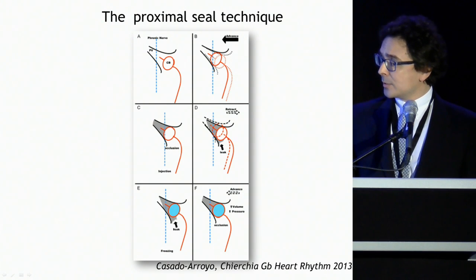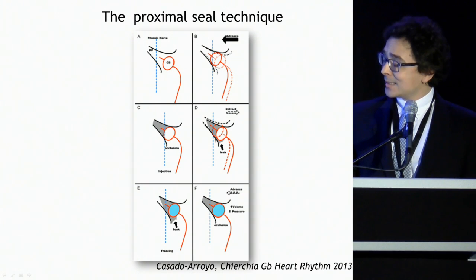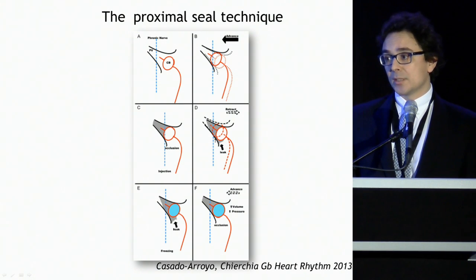What does that mean? That means that you have a stiffer and larger balloon, which is probably more difficult to advance towards the phrenic nerve's course. Not only that, but this increase in volume usually closes the leak without further need of advancement.